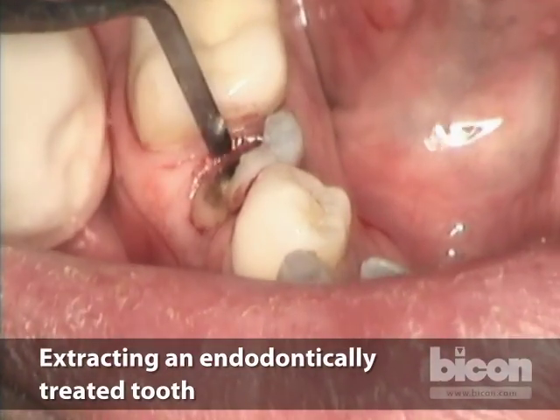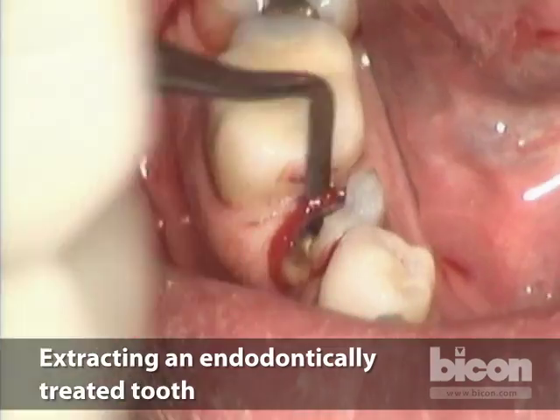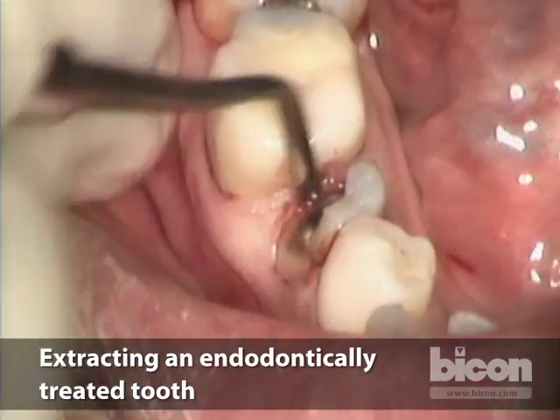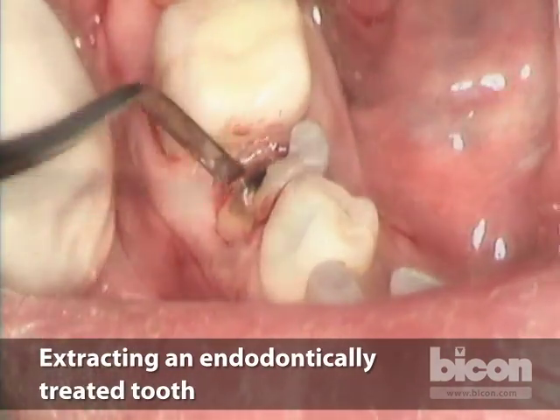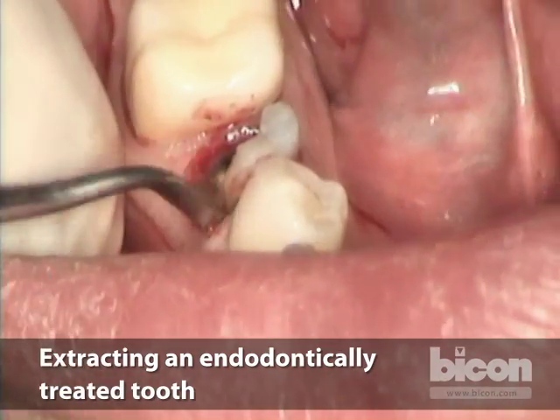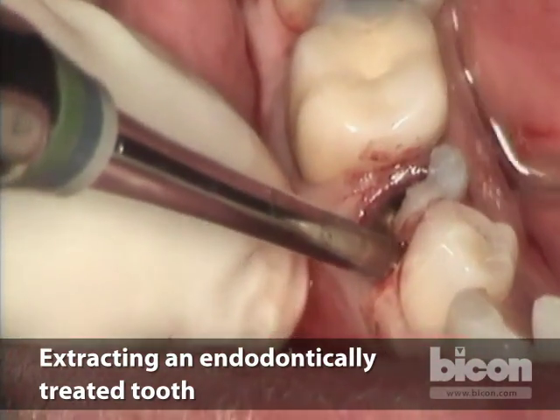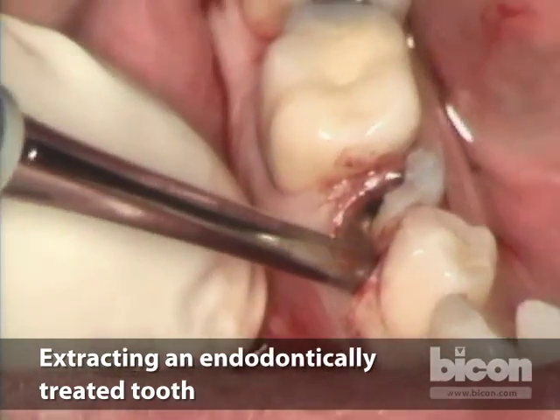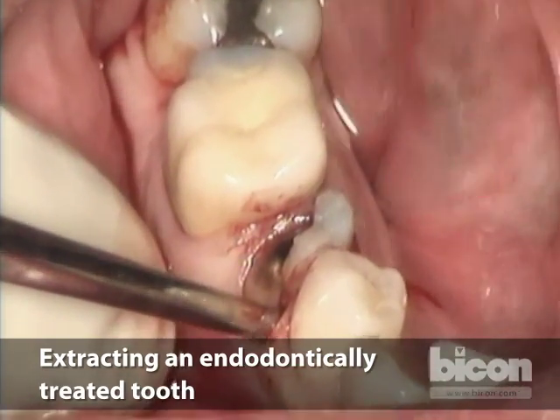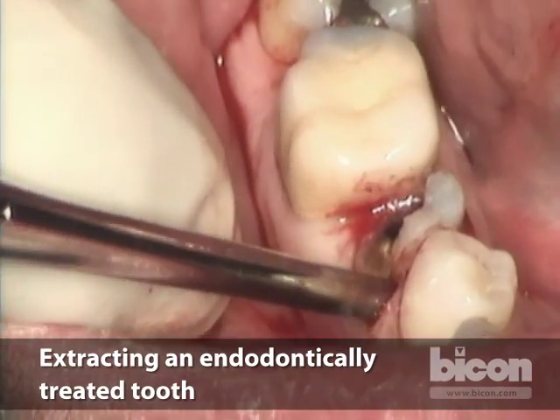The tooth is loosened without need for a lot of elevation — there will still be use for that, but not as much. A longer periotome is used to go a little bit farther along the root, trying to get as close to the apex as possible. To complete the mobilization, we resort to an elevator, which gives us the chance to start lifting the root and getting a sense of how it wants to move.